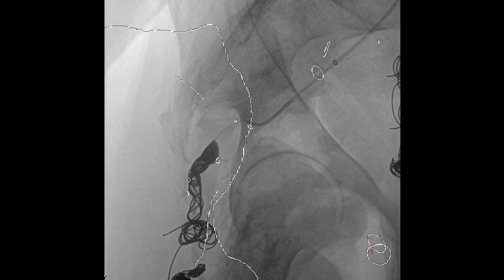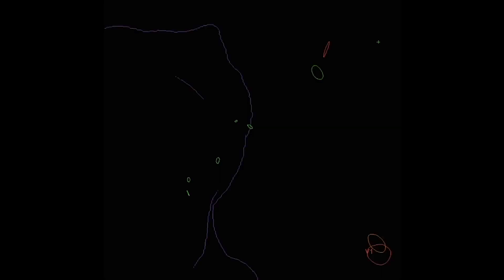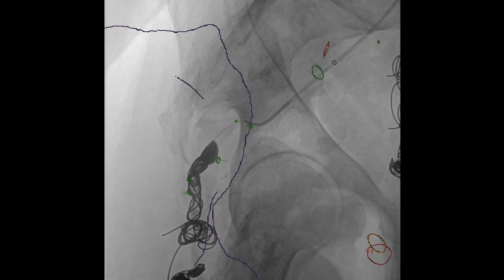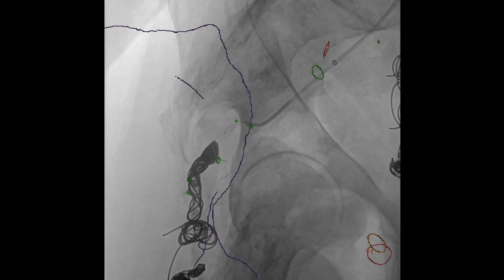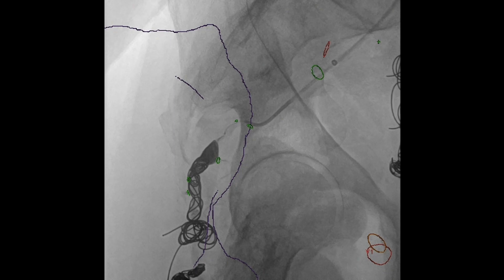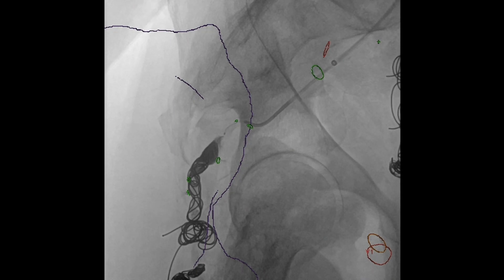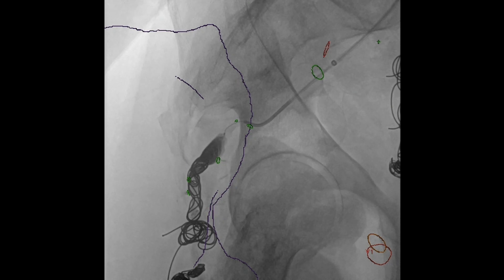We're injecting onyx again here — this is sped up so we can show the entire case. The whole embolization procedure took about an hour and a half. We backed up the micro catheter a little and continued taking out the superior gluteal branches.